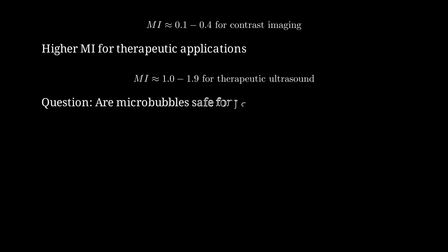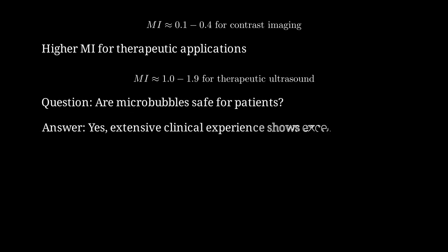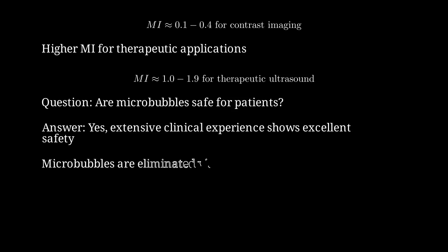An important question: are microbubbles safe for patients? The answer is yes. Decades of clinical use with millions of patients demonstrate excellent safety profiles. Microbubbles are rapidly eliminated from circulation via exhalation through the lungs within 2 to 10 minutes. The circulatory half-life is approximately 2 to 6 minutes, minimizing exposure duration. Let's explore advanced imaging modes that leverage microbubble properties.